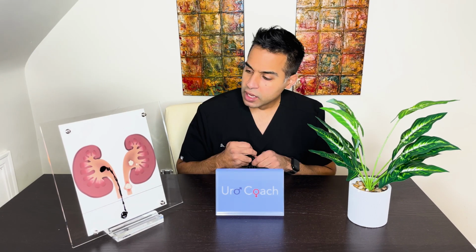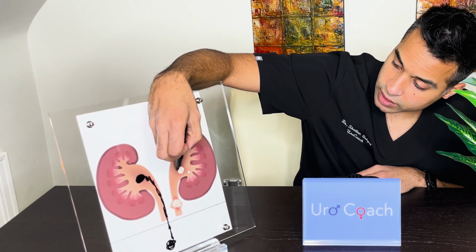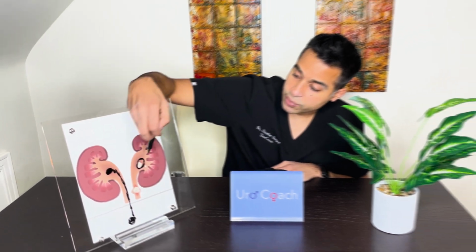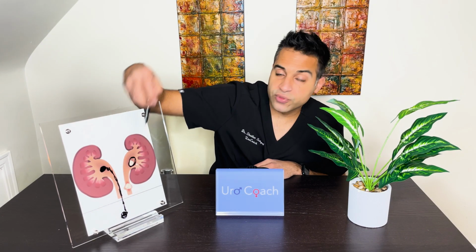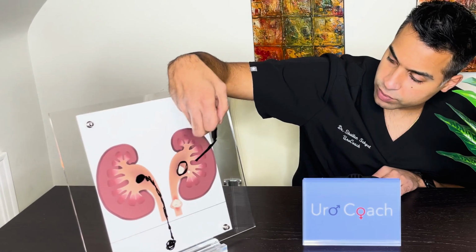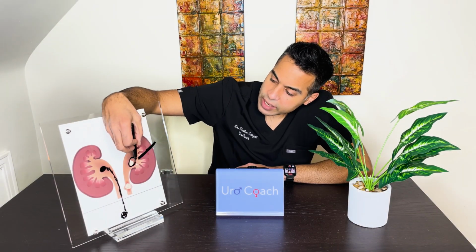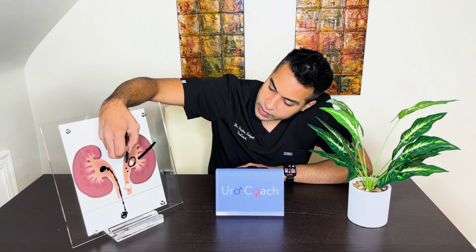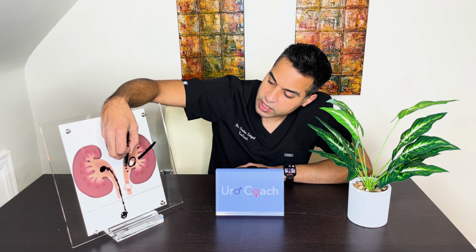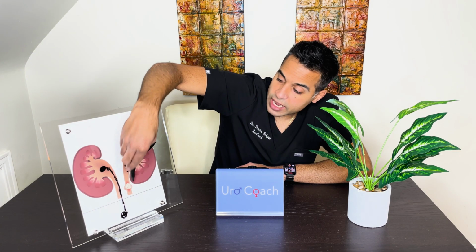Obstruction's about to happen. Let's take a look at this stone over here. This is a non-obstructive stone in the kidney, all right? This is not causing any problems right now. If we were to drop into this location, it would. But right now, it's not causing any problems. Sometimes, for a variety of reasons, we'll apply shock waves to this stone. Sometimes we'll go through the kidney here and access this stone and remove it. But what can result are some small fragments, right? If we apply shock waves to them, if we go through the side of the kidney and get this stone, there can be some dust or sand-like particles that result here. They can get lodged in the ureter and cause an obstruction.